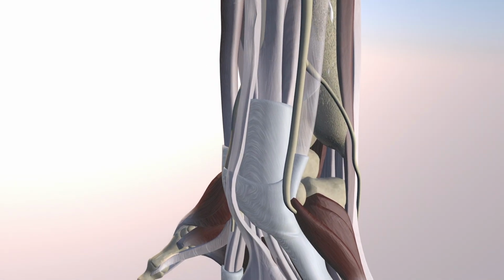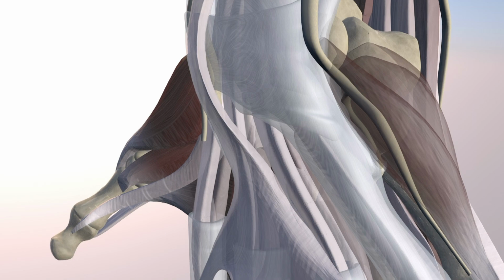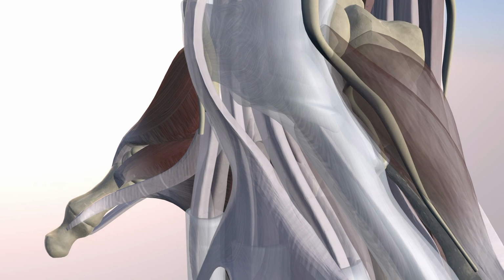Now we're making the flexor carpi ulnaris muscle translucent, and we're going distally, and we're following the course of the ulnar nerve as it passes over the transverse carpal ligament, and then it branches off into the deep and superficial branches.